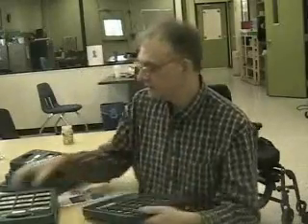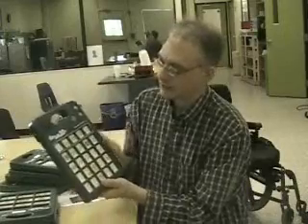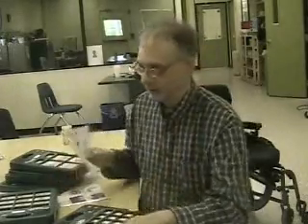But that's basically the GoTalk 9. In order to make overlays for these, you'll use a program called Boardmaker. Boardmaker is by Mayer-Johnson, the same place you can buy these from.